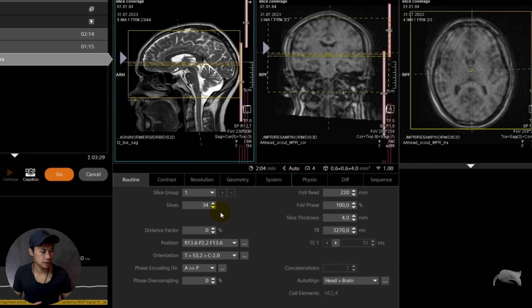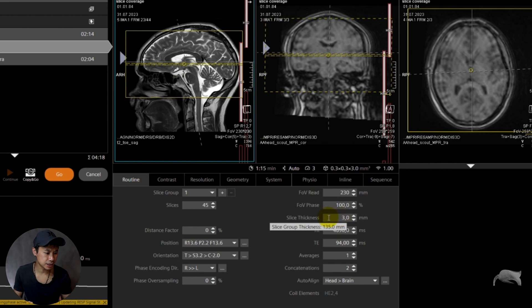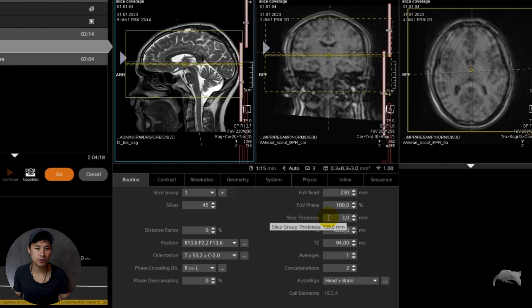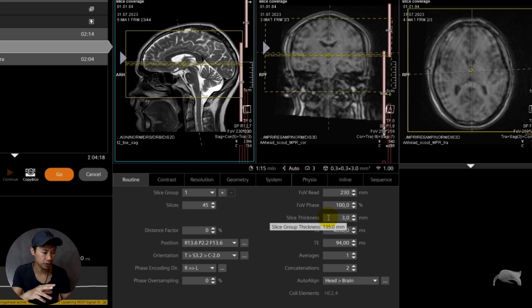But how do I know that? Let's open the T2 again. You can see if you hover your mouse over the slice thickness, it says slice group thickness 135 millimeters. That's a very helpful tool — that's the tool I'm talking about.